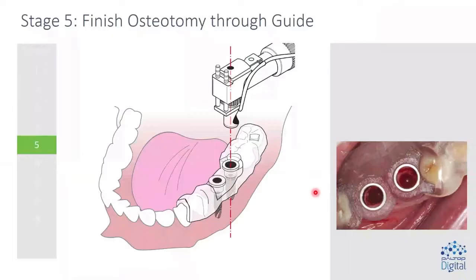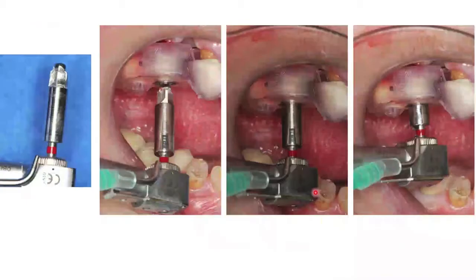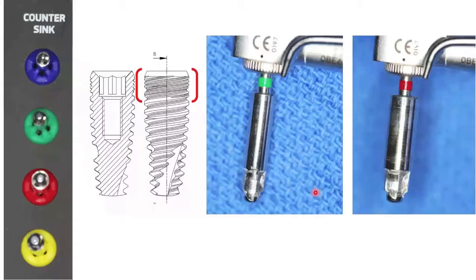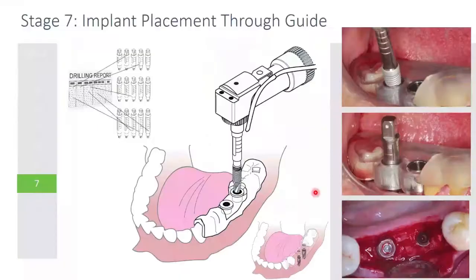We've finished the osteotomy. We countersink if necessary — most of the time with Paltop you're not going to countersink, only when the bone is very dense. The countersink is also guided by the sleeve. The reason we don't use it most of the time is that the coronal portion of the implant — where the micro threads are — gives a lot of stability. So unless the bone is very dense, I want that additional stability. You carefully choose whether you want to use the countersink or not.